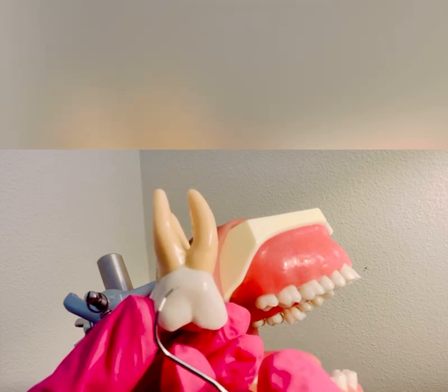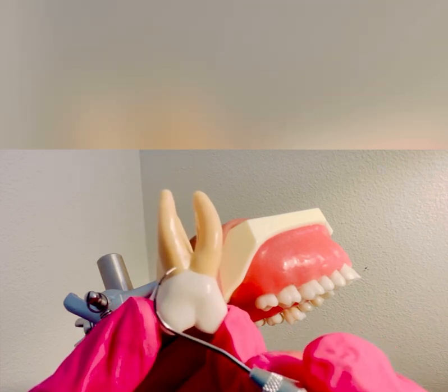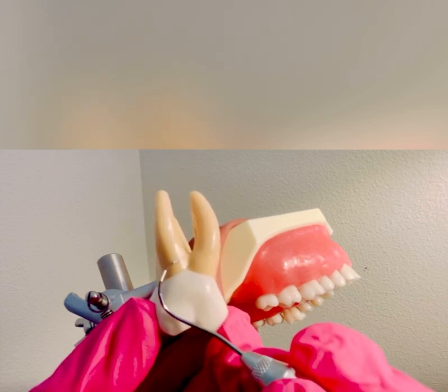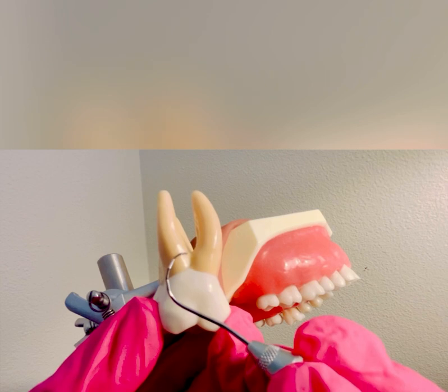Going back to the correct working end, you want to start right around the distal line angle, and I like to do a very light assessment stroke as I feel for that furcation.